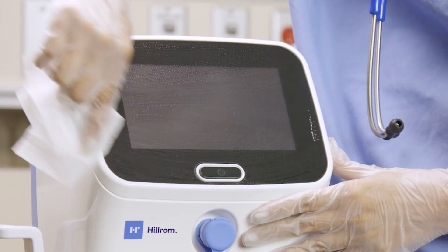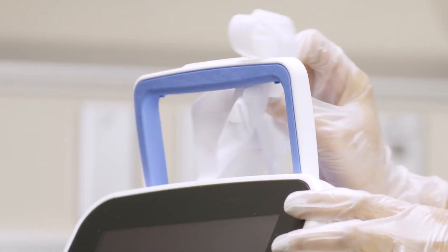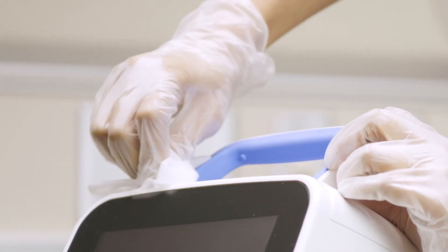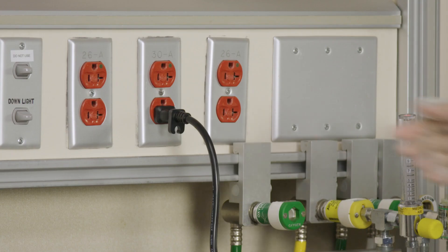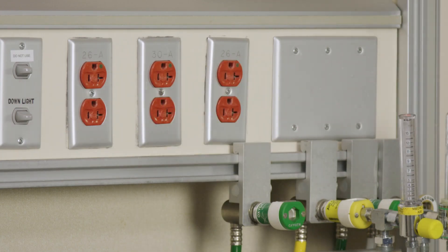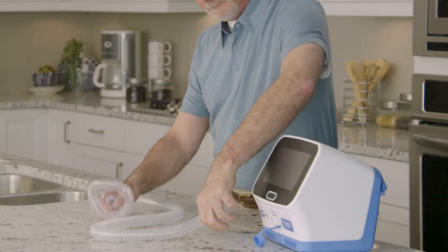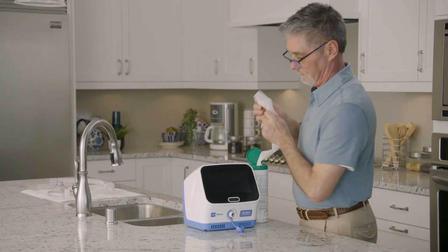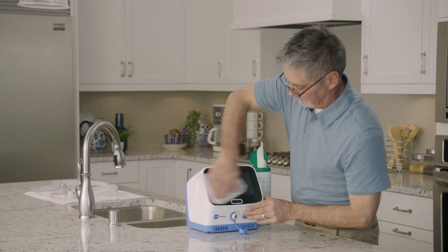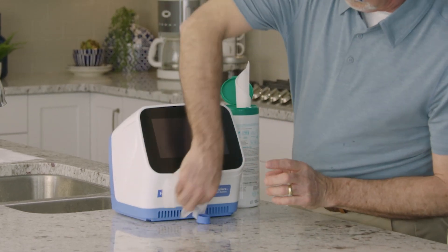It is important to clean the control unit and stand between therapy sessions, when visibly soiled, or according to facility protocols. To do so, power off the control unit and disconnect it from the power source. Disconnect the patient circuit and any accessories from the control unit. Thoroughly wipe down the control unit; it is recommended to use a soft cotton cleaning pad moistened with a compatible cleaner.